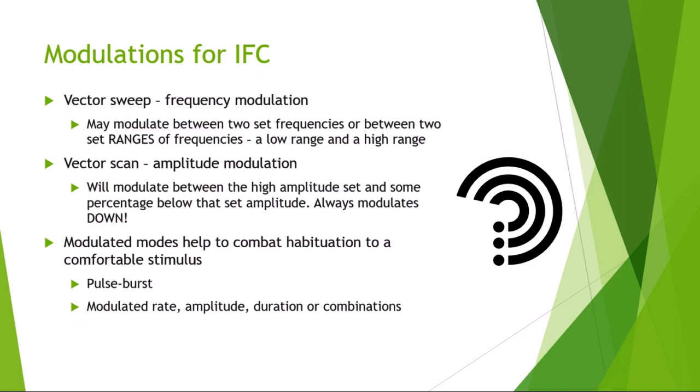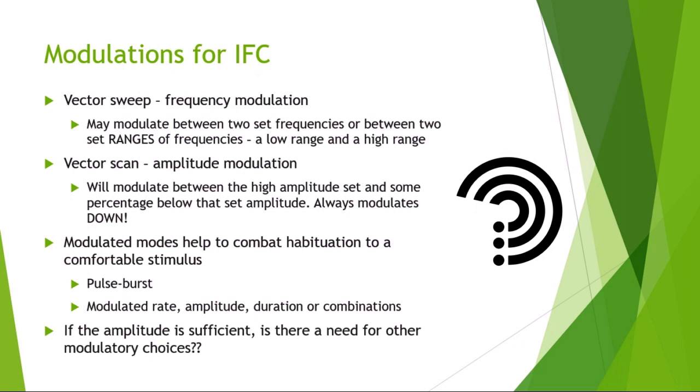Modulated modes are supposed to help combat habituation to a comfortable stimulus. So you can have combinations of those, but if the amplitude is sufficient, do you really need other modulatory choices? If you coach your patient and keep turning up the amplitude so they don't habituate to it, do you need modulation? That's something that we can try in the lab.